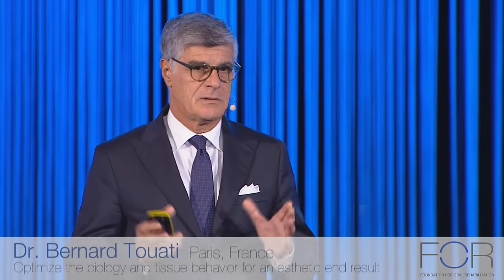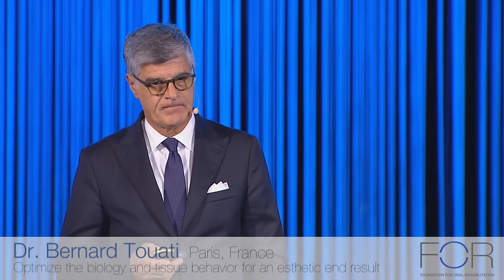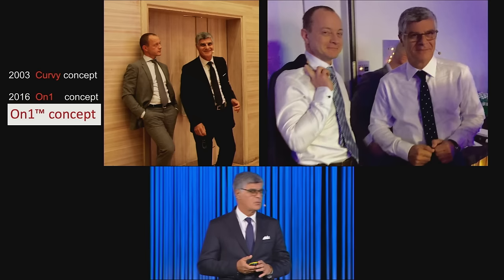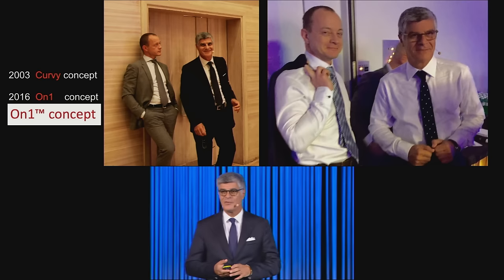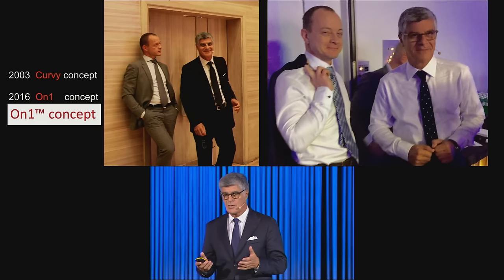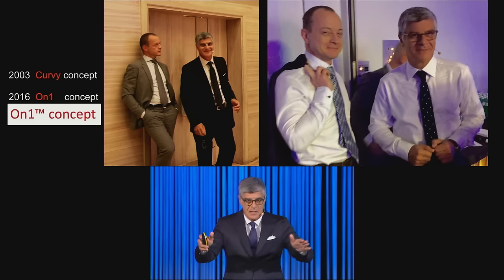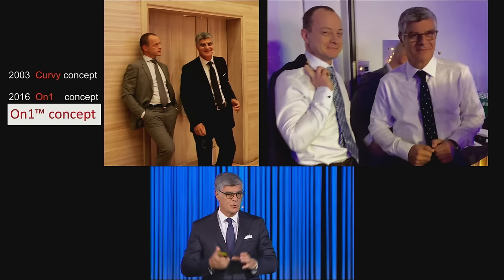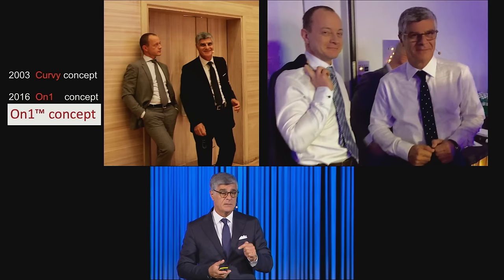Today we're going to concentrate on something that maybe we have a little bit neglected: the transmucosal zone. I'd like to show you a concept developed with my friend Eric Rompin. We started 13 years ago with the curvy concept — you've seen some of the restorations by Iñaki, which have this concave transmucosal profile. We have always been concerned by this zone.